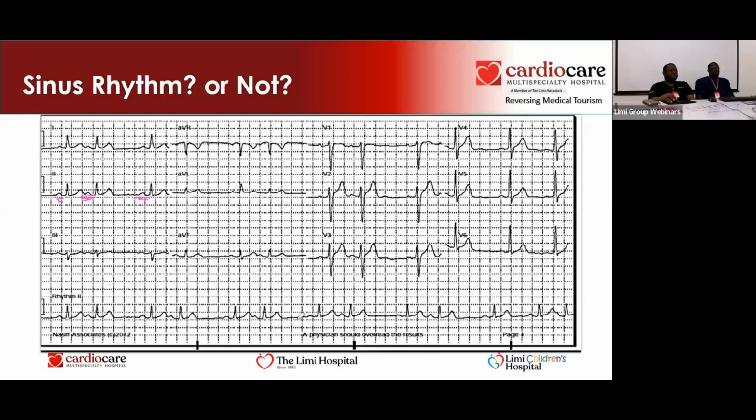Yes, QRS, PQRS. And after every P wave, is there a QRS? The answer is yes. Every P wave has a QRS. Now, the more pertinent question. The P waves, do they all look alike? Do they all look alike?